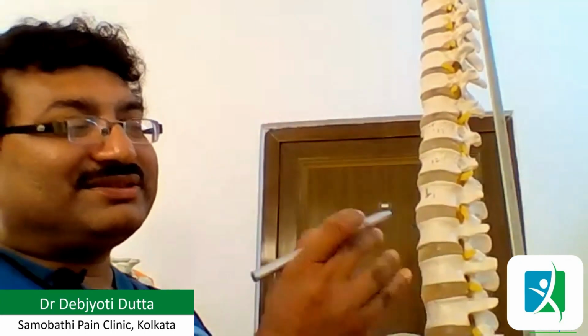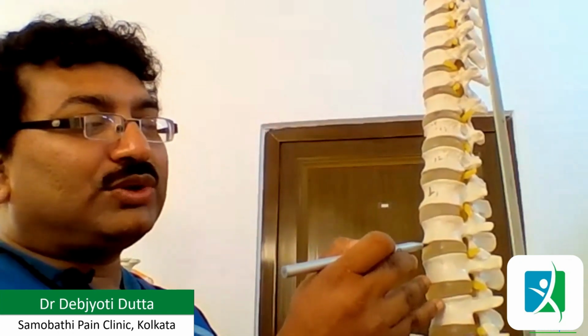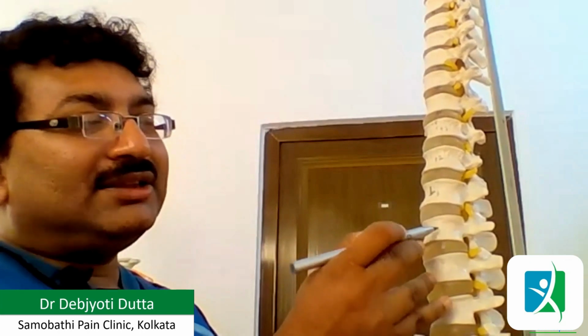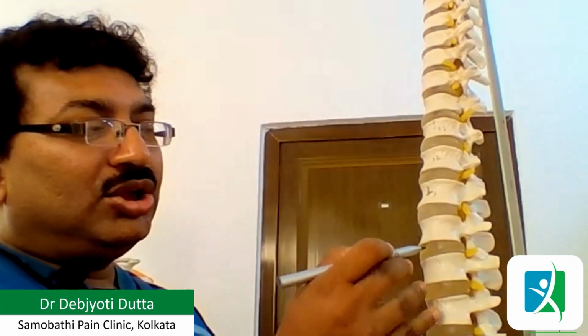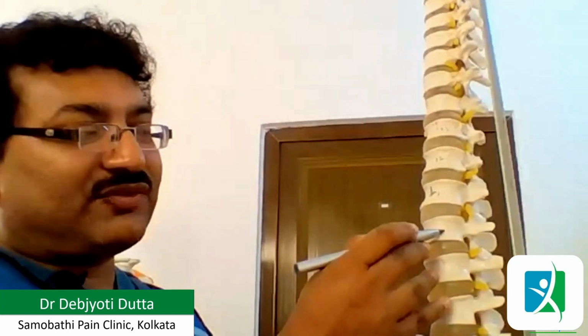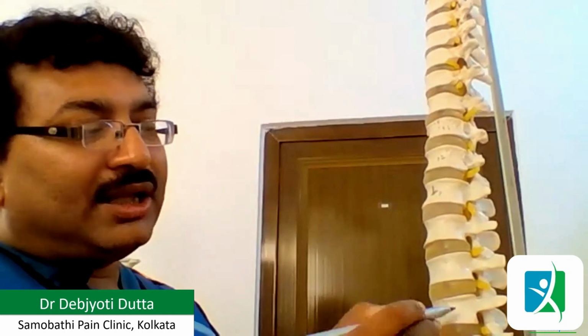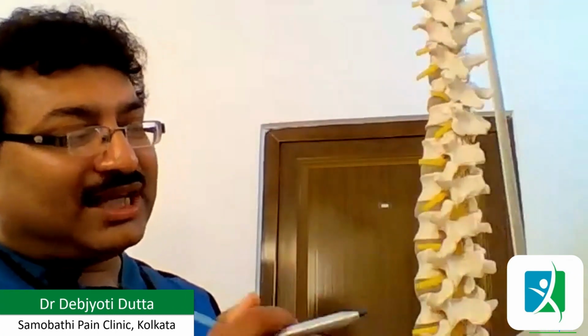Remember, L2 and L3 are closer to the L2-3 disc: upper 2/3, lower 1/3 in case of L2, upper 1/3, lower 2/3 in case of L3, and L4 is almost at the middle. So in between the vertebrae we have the disc, and we have to come from the posterior side.